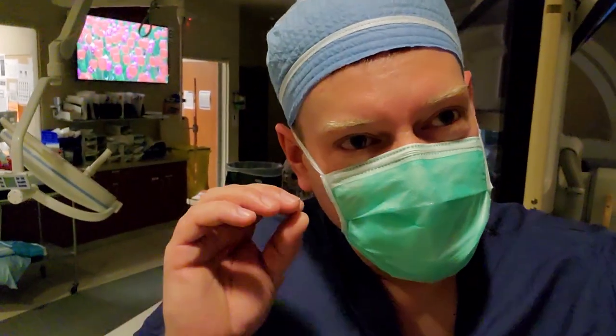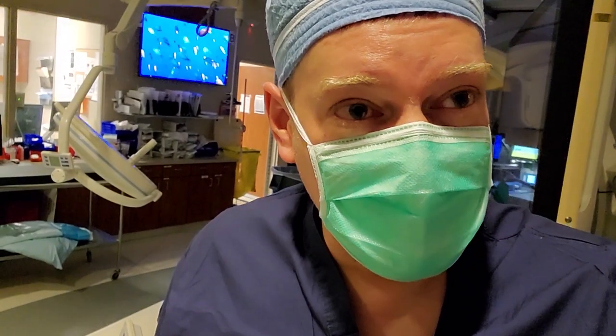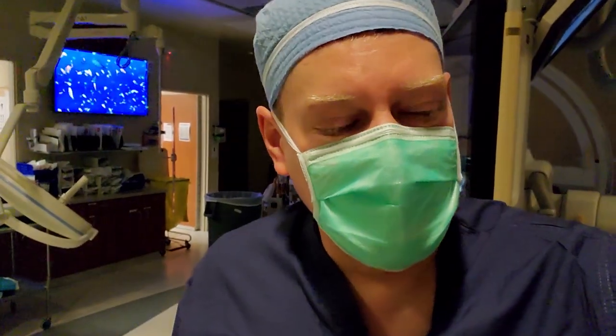So guys, that's just a few points of cable management that are going to save you tens of thousands of dollars. And I'm saying that's for foot controls, hand controls. It's in a cath lab like this, all sorts of cables, they need to be organized, and any signs of stress, they need to be relieved, because either the cable's too heavy, you know, if they get it all wound up in a bundle and it's hanging at the connector. So we try and extend that point of strain using a strain relief. And obviously my favorite is gonna be your shrink tube, dual layer shrink tube. I know, I use a lot of it, but because of that, I have a lot less failures than a lot of other people do.